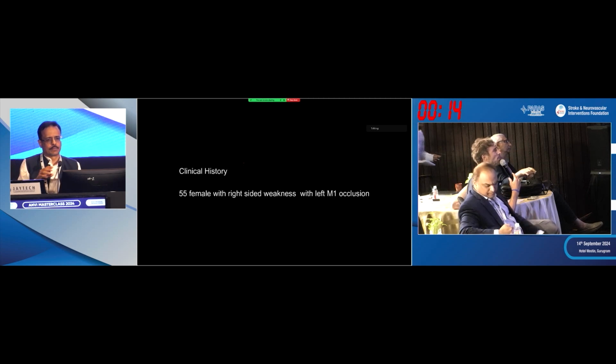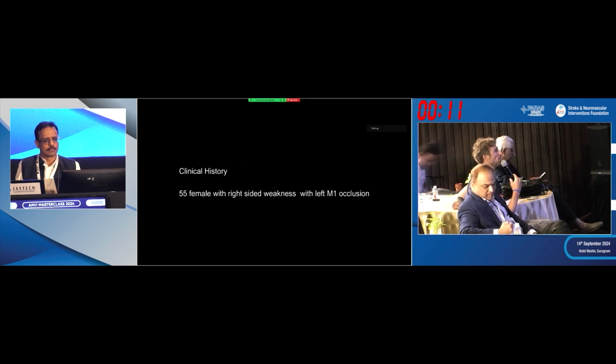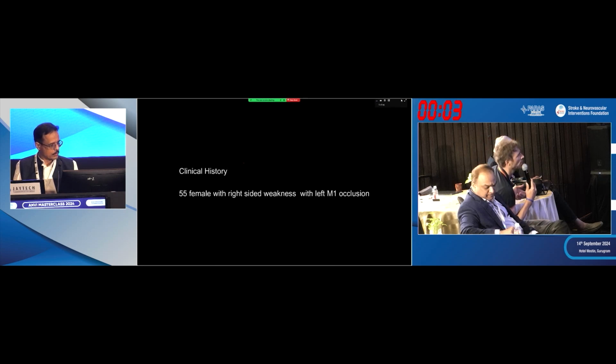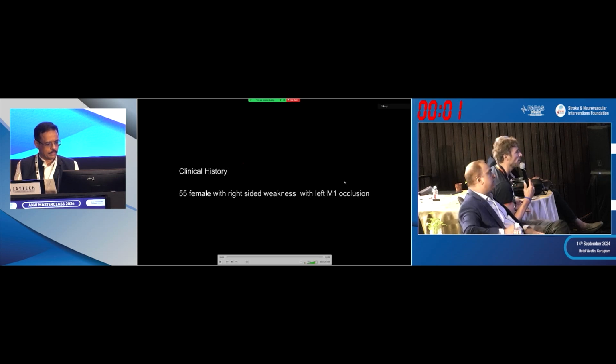The thrombus is extremely fresh. So if you go through this section, it is 90% thrombectomy success. So the only thing you have to do is to go through. To go through, the idea that you should go with a big J-shaped catheter is a false idea, since you can jump into the false lumen doing this blindly, and then you can worsen the false hematoma and close the true lumen and close the case.